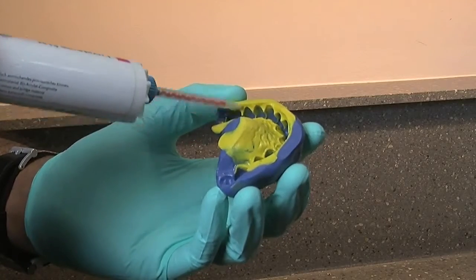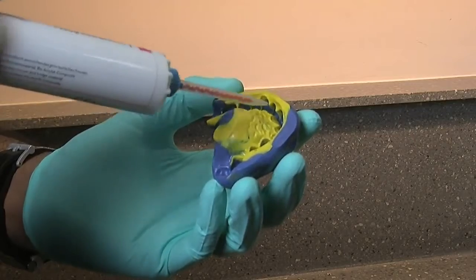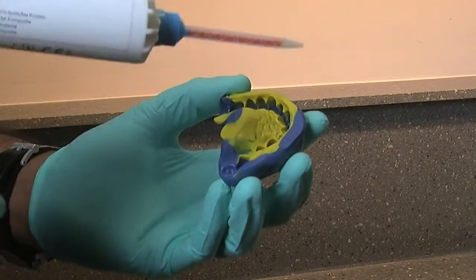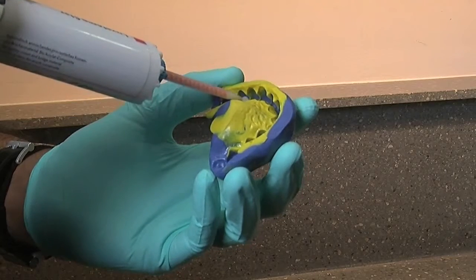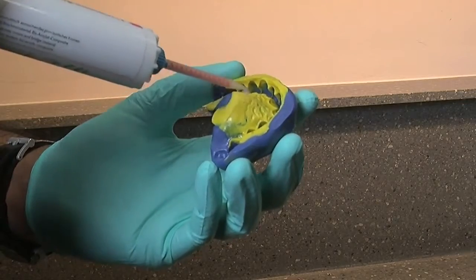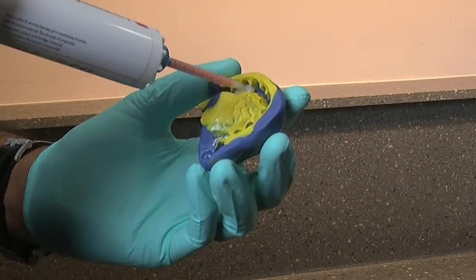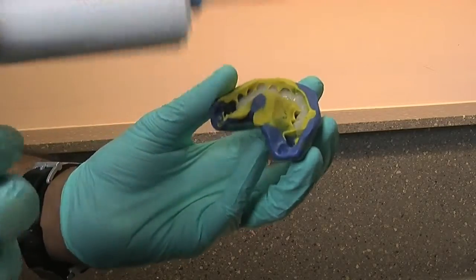So I'm going to start, this is the upper left 5 area, I'm going to go all the way to the upper right 4, and the important thing is to do this reasonably fast. I normally time this, so I get it done within about 2.5 minutes from start to finish to set in the mouth. So I'll start syringing there and keep going around, keeping the tip in the material. And that's really it. It's fully loaded.